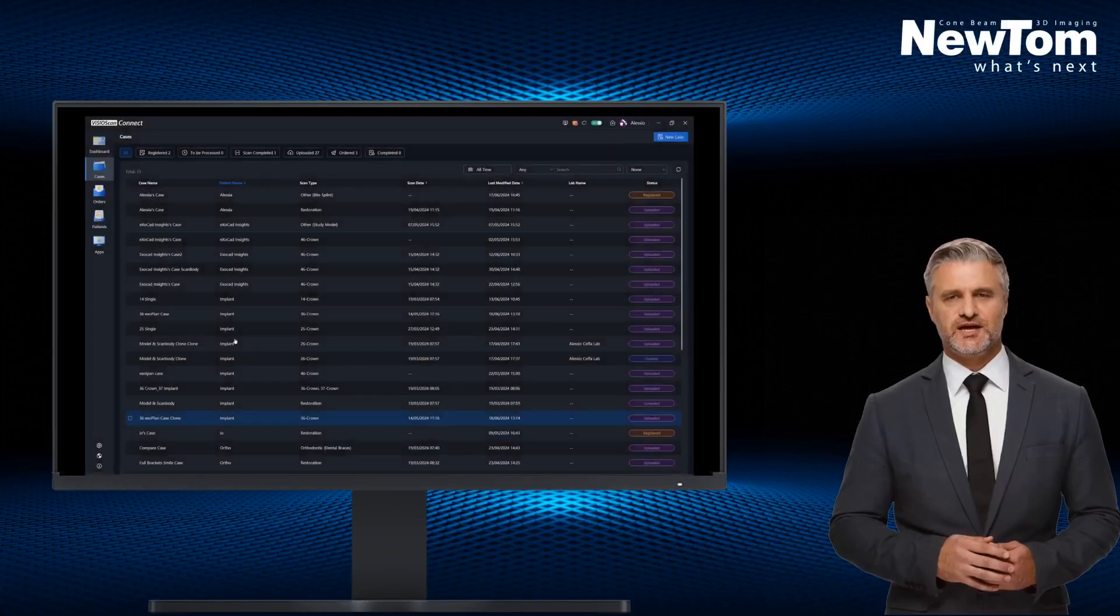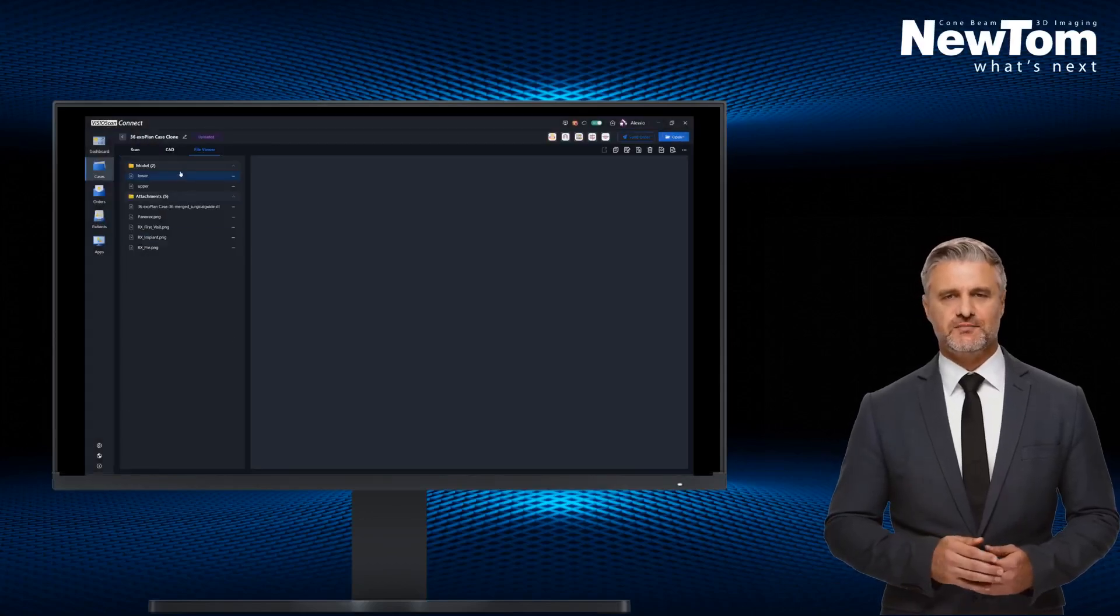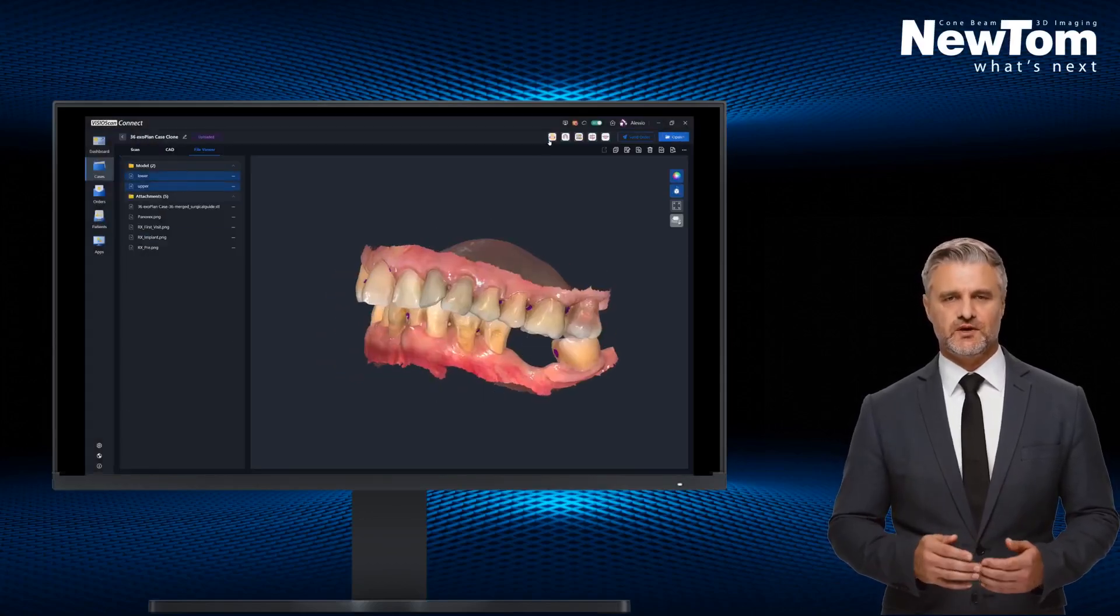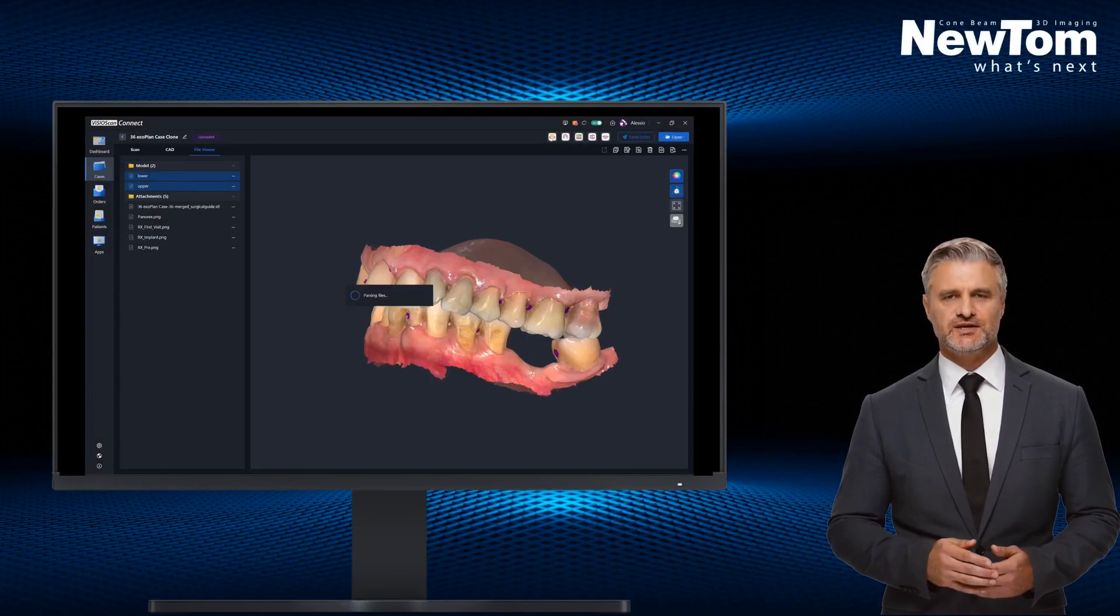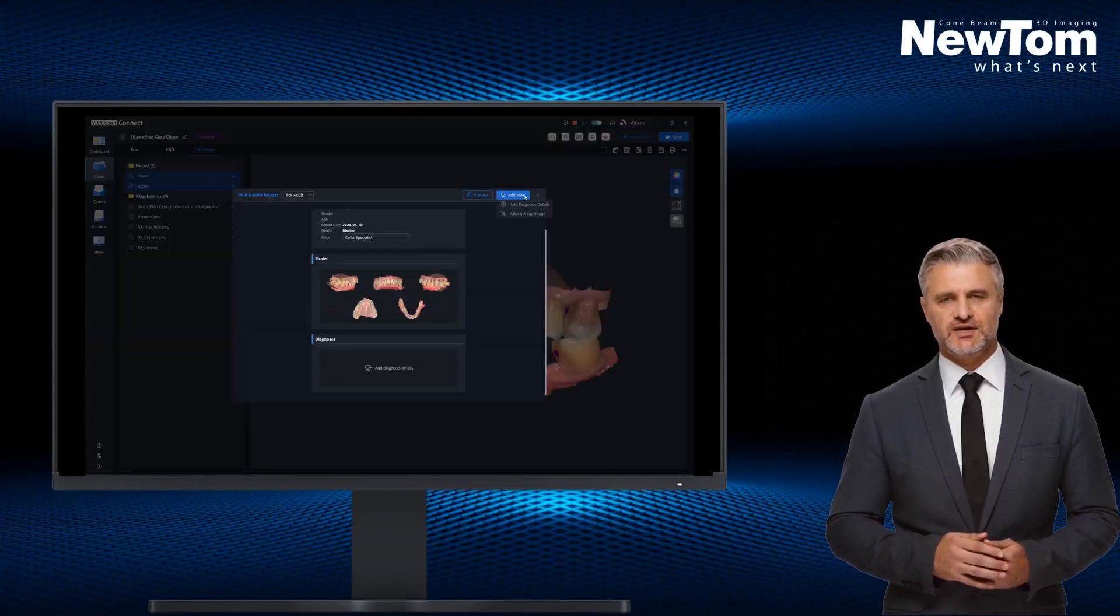We open the desired case and select the report application. The program automatically inserts the patient's data and images.